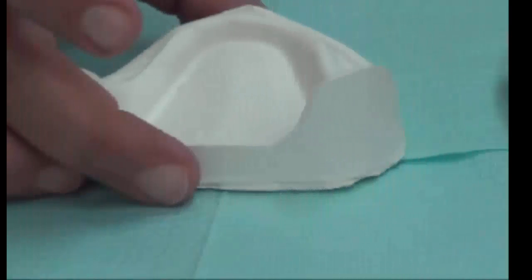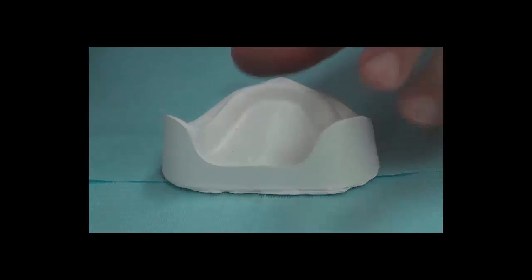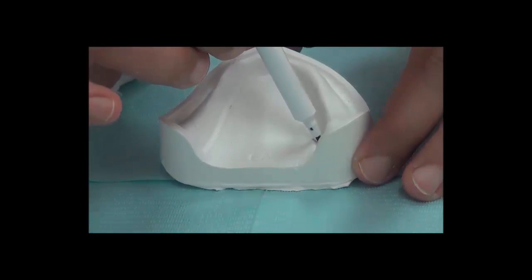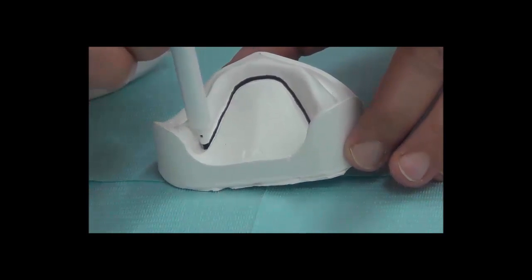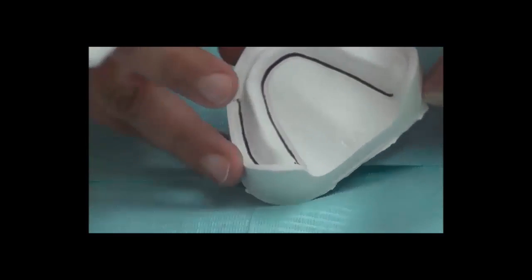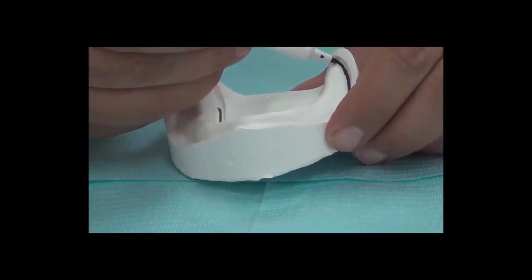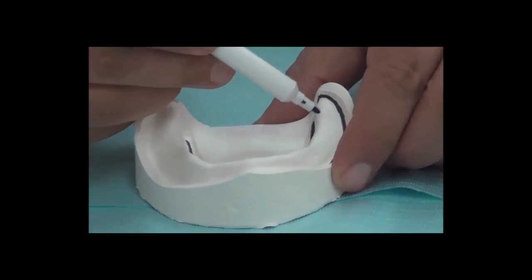For the lower method, we are going to repeat the drawing of the sulcus. So once more, we put our pen vertically, or pencil if you have a colored pencil, and just let it run through the deepest areas of the cast. In the posterior area, we should cover, inside the tray, the whole of the retromolar pad.